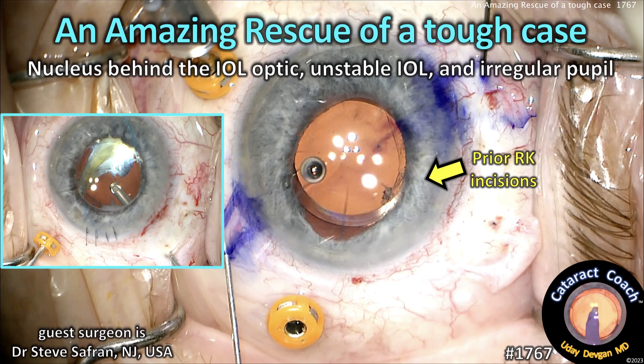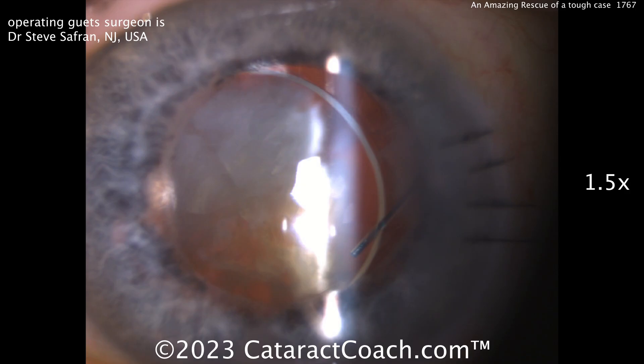CataractCoach.com — an amazing rescue of a tough case. Nucleus behind the optic, unstable IOL, irregular pupil, prior RK cuts.